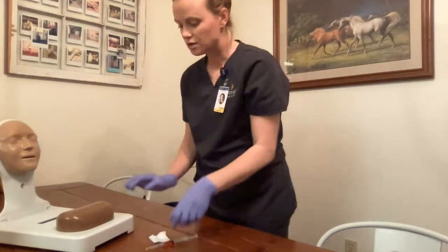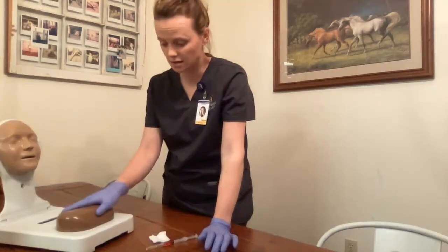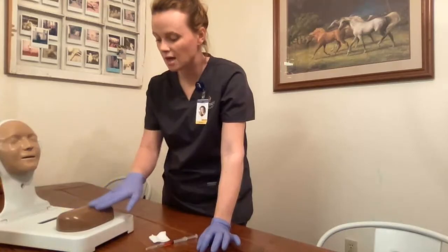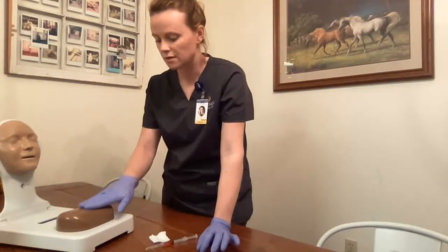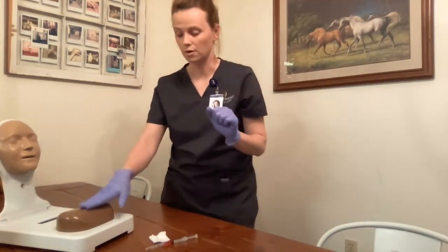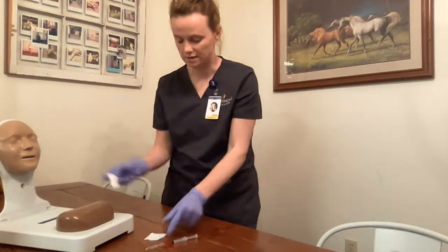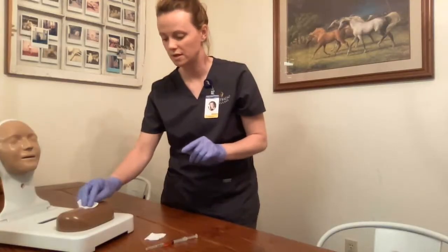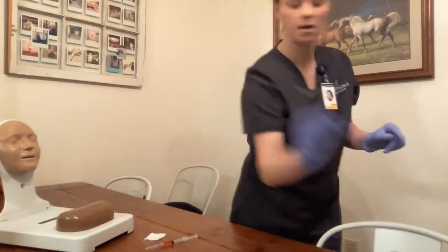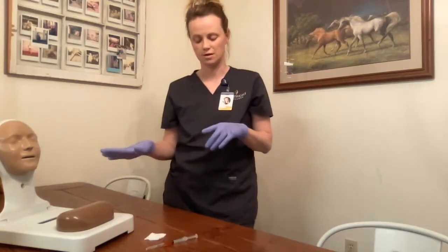After finding the location, I assess the site — checking muscle size and integrity, looking for any signs of bruising, irritation, or edema, and gently palpating for any tenderness, masses, or hardness. The site is acceptable for use. I then clean the site starting at the center and working outward two inches. I dispose of the alcohol wipe and allow the site to air dry — I do not want to touch it once it is air dry.